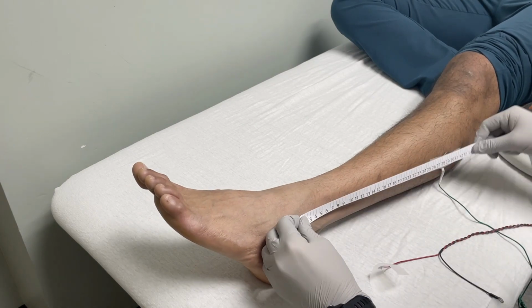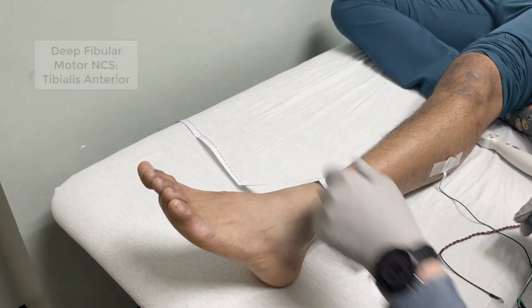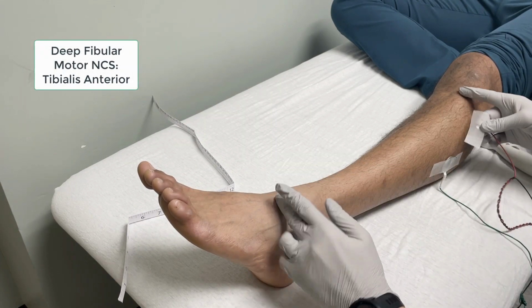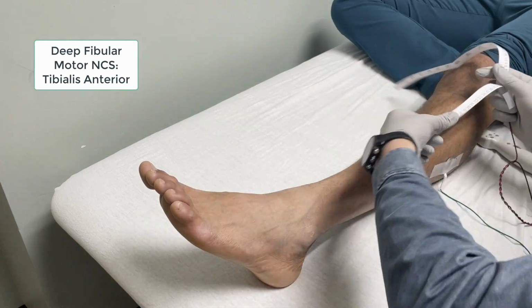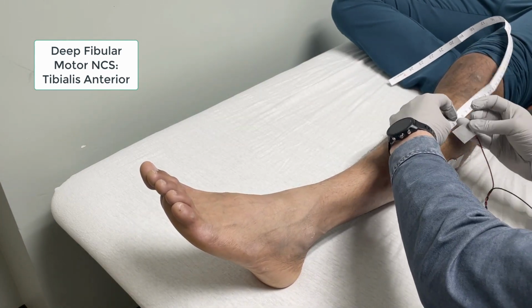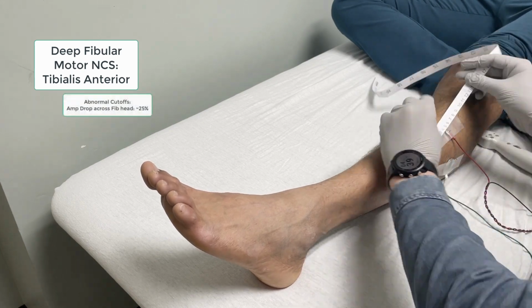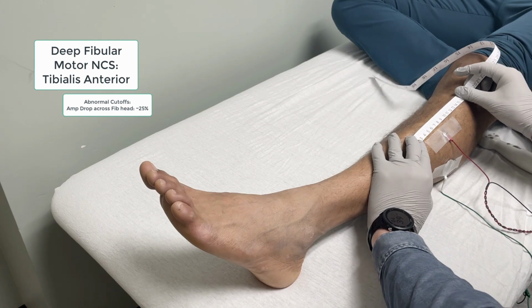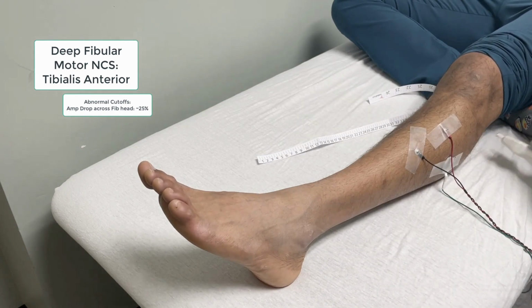Next, let's review the technical performance of tibialis anterior in a motor nerve conduction study. To start, measure the total distance from the lateral malleolus to the tibial tuberosity. Divide this distance into thirds and place the active electrode in the first third along the tibialis anterior muscle. Next, place the reference electrode halfway between the tibial tuberosity and the lateral malleolus.